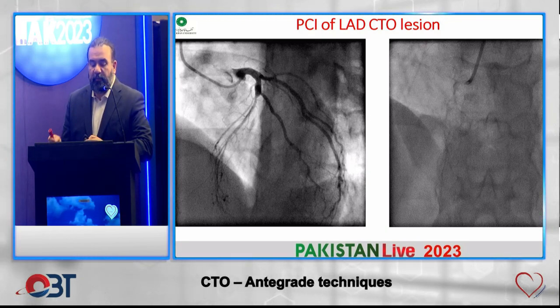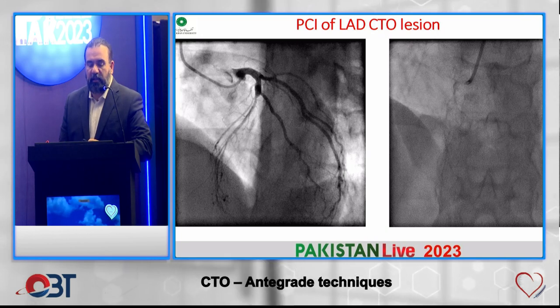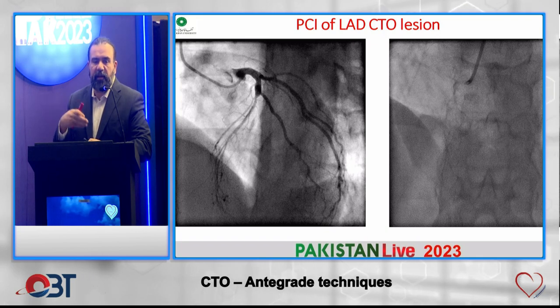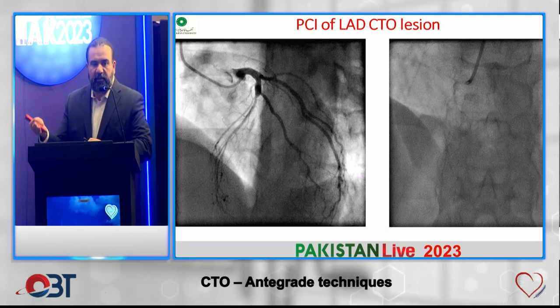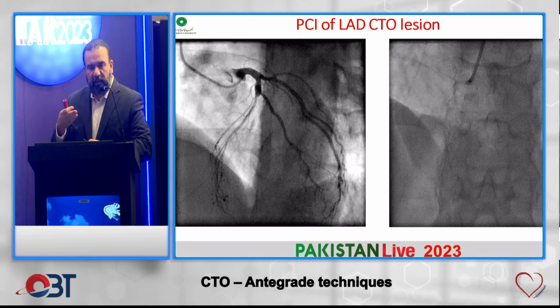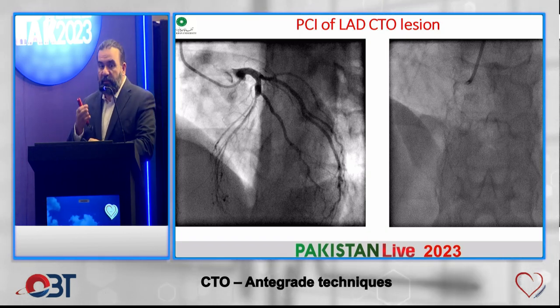लेकिन I think अगर इस मरहले पे हो जहाँ पे diagnostic angiogram हो and you're going to do something, उस वक्त CT करना मुश्किल होता है. So unless you take the patient off the table and say कि जी this is a complicated procedure, hame CT karna padega, but that adds cost. So I think sometimes you have to make the decision while you're still doing the case. But that's a good point.